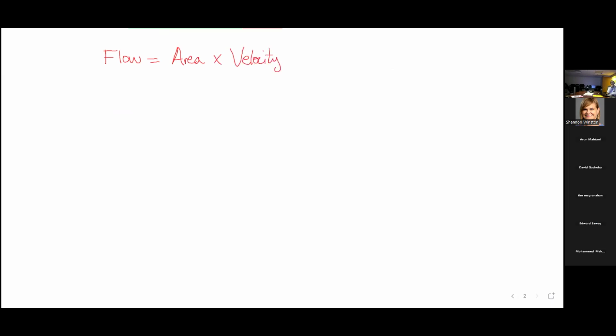Interesting, right? For everyone that works with echocardiography, with images where we're measuring blood flow, what we're trying to determine is this: let's say we've got an image right here, and in the center, we have an axial view.